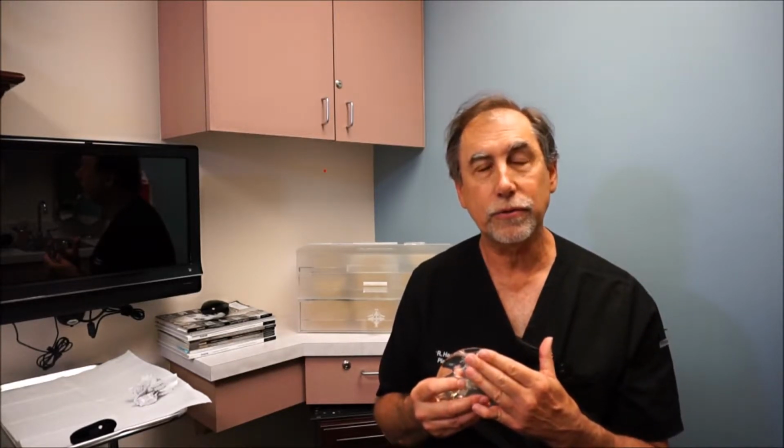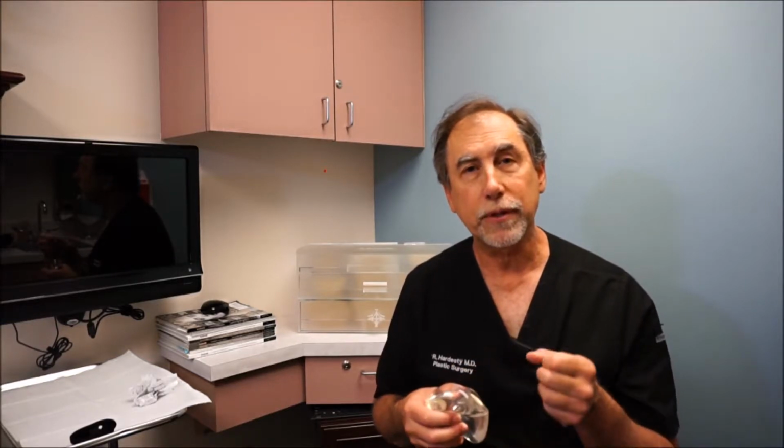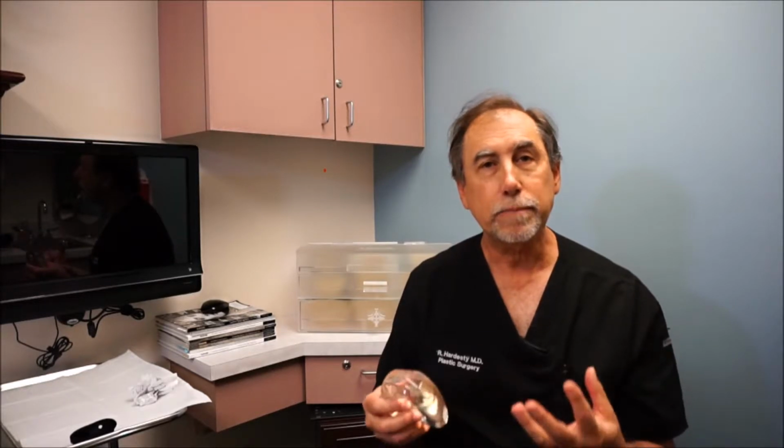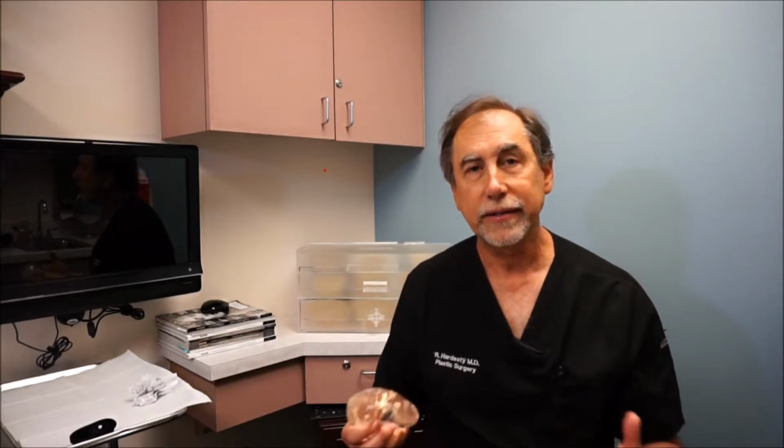Biofilm is a coat of bacteria that cannot be cultured but is totally adherent to the implant. It was discovered up in the high mountains. A microbiologist went up to the stream and cultured the water coming over the top, and it grew nothing. But he then cultured the moss that was growing, and it was full of bacteria. This bacteria is adherent. In the old days when patients had capsules, we would remove the implant, take a culture, remove the capsule, and put the implant back in, but it had a relatively high incidence of recapsulization.